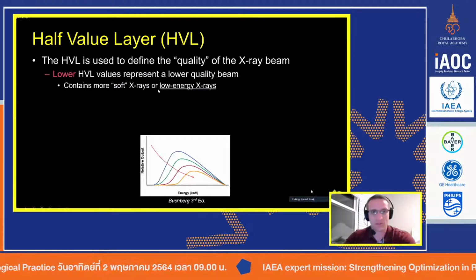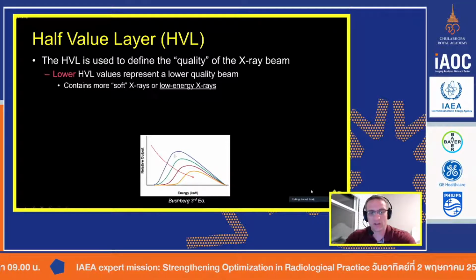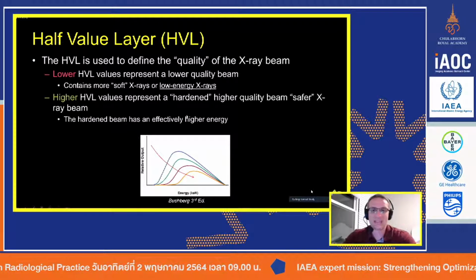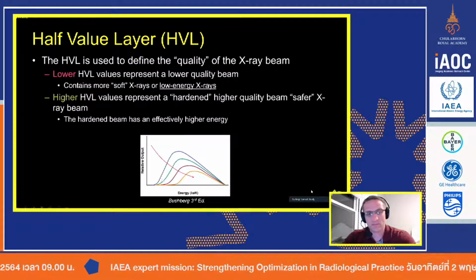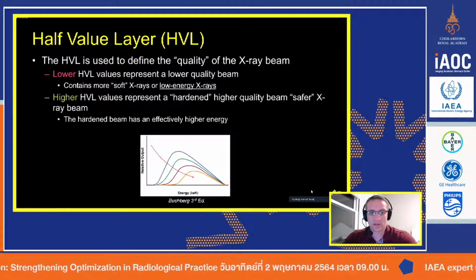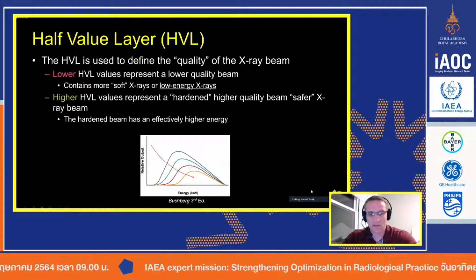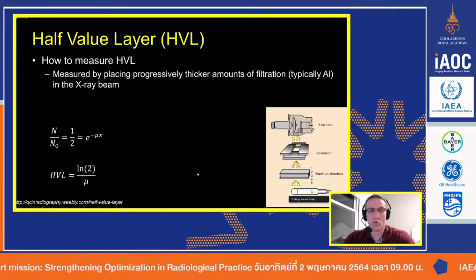And we do that for this purpose right here: when you use more filtration in the X-ray beam, you're absorbing these lower energy photons, X-rays. And that's a good thing. It creates less skin dose, so it's a safer, quote unquote, X-ray beam. But the other thing it does is you can see the average of this profile. You see how this peaks right here. Let's just assume that's the average of the profile. Now, if you add a little bit of filtration, it shifts a little bit to the right. And if you add a little bit more filtration, now the average is shifted a little more. It keeps shifting towards higher effective energies. It makes the beam more penetrating.